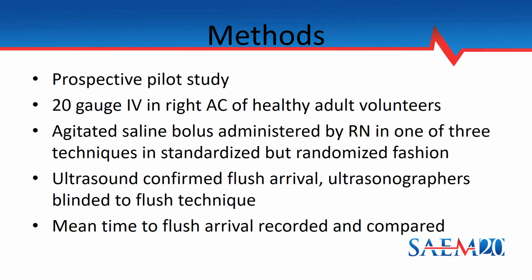An ultrasonographer, who was blinded to the flush technique via a divider, confirmed flush arrival to the right heart using the most optimal cardiac window. The windows included modified peristernal views, apical four-chambered views, and the subxiphoid views.